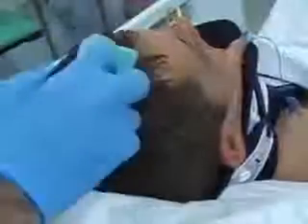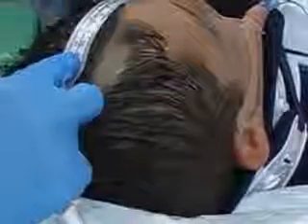Don non-sterile gloves. Place the patient in a supine position and put the water-absorbent underpad beneath the patient's head with the plastic side down. Wash the patient's scalp with soap and clean water using the washcloth or brush. Dry the skin with a hand towel and shave as necessary. Identify the anatomical landmarks and mark the incision site.